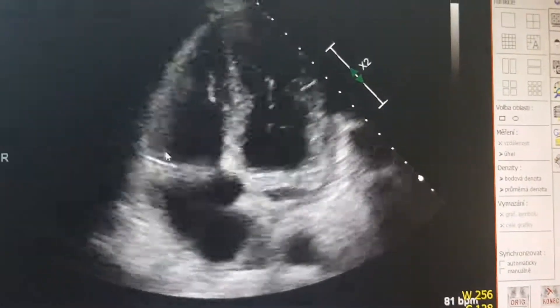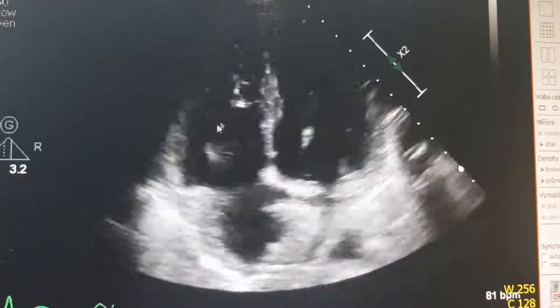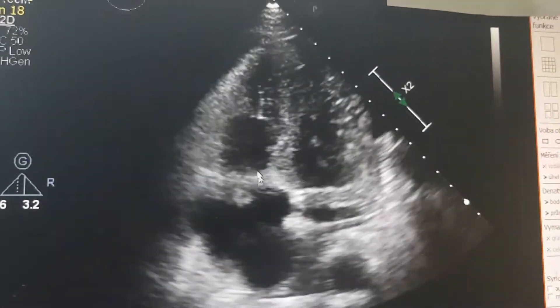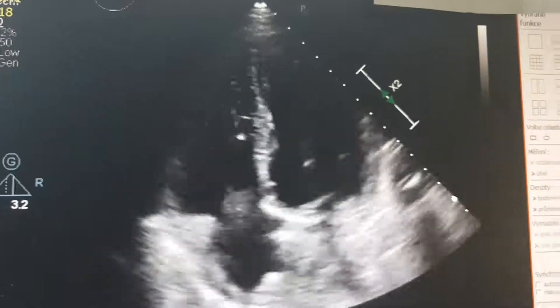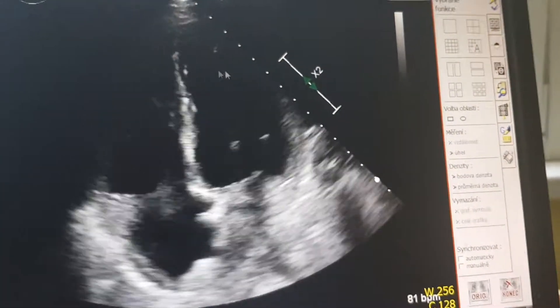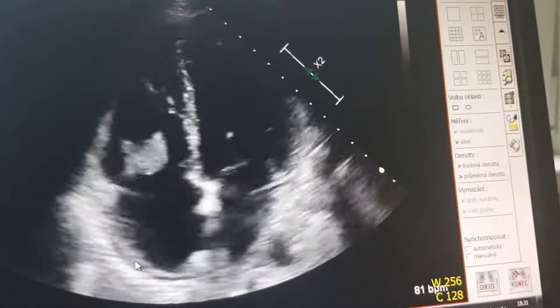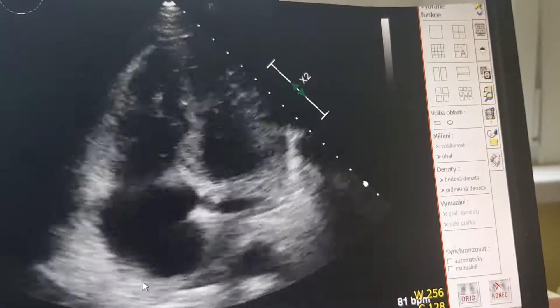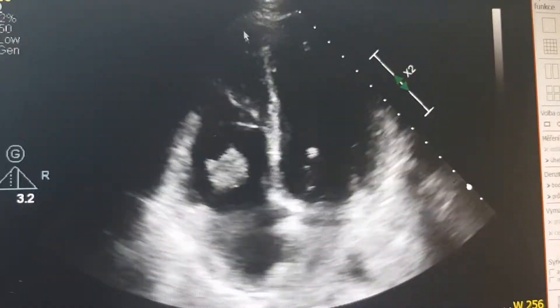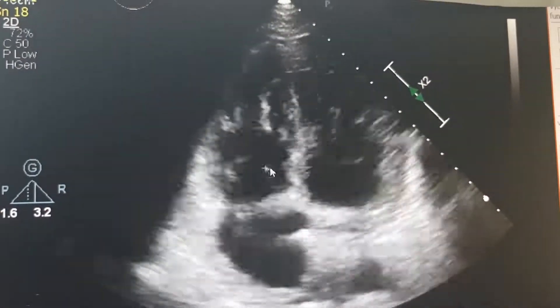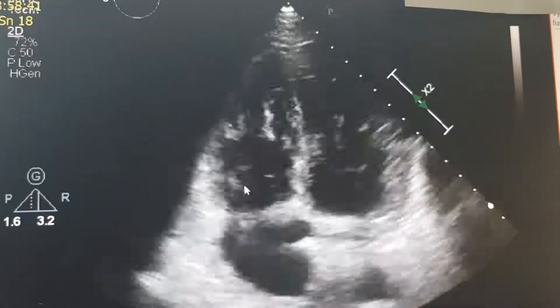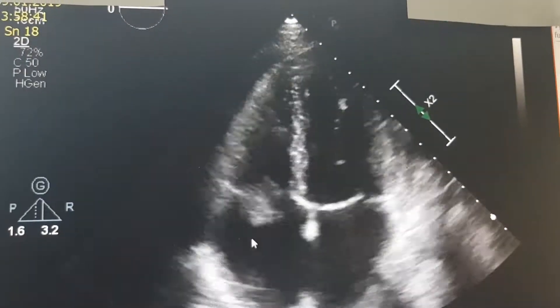Here you can see that there is a vegetation on the frontal cusp. It's relatively big. The ejection fraction seems to be fine and there seems to be a very small pericardial effusion here. This is infectious endocarditis — a vegetation on the tricuspid valve.